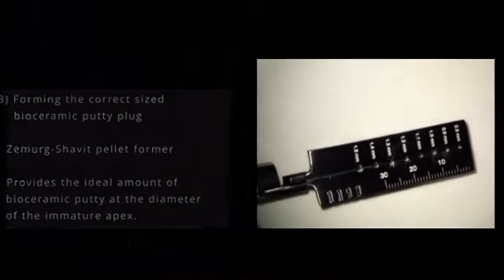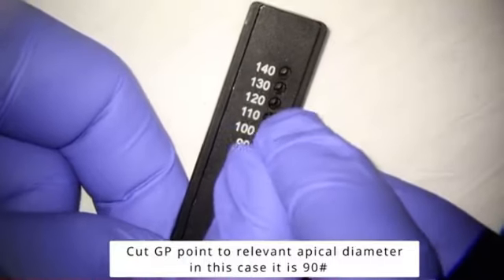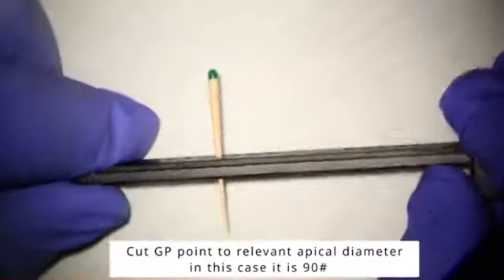To use this instrument correctly, you cut a GP point to the relevant apical diameter. In our case, it's a 90.